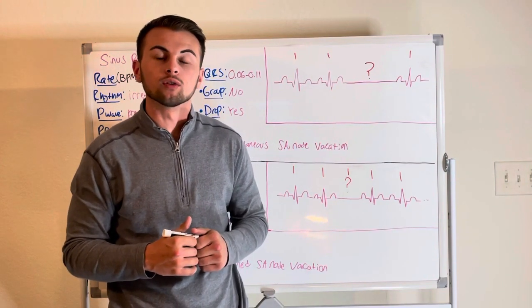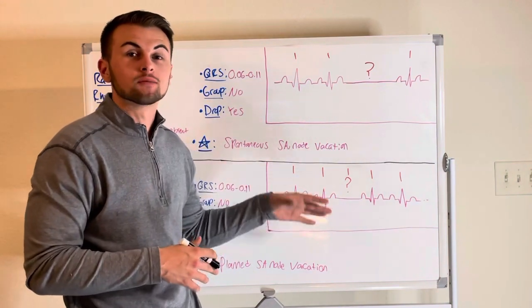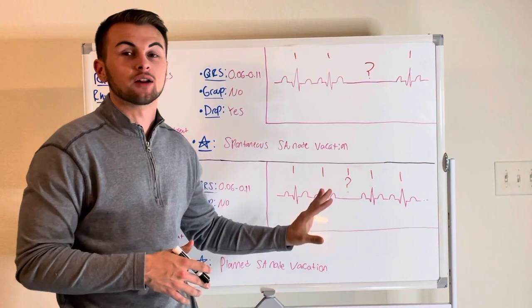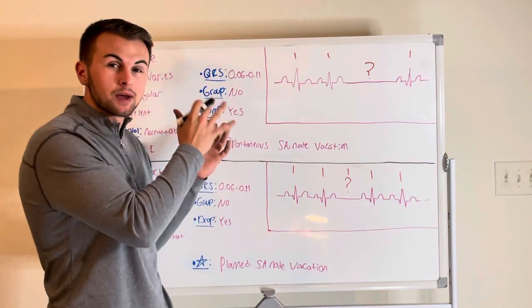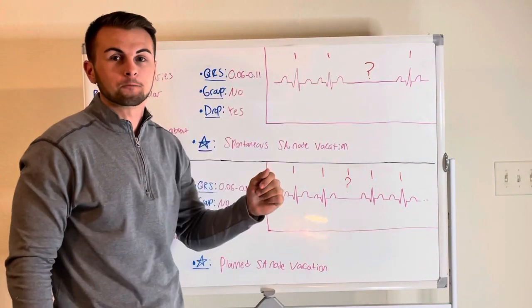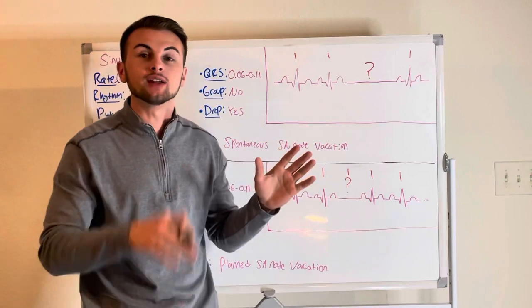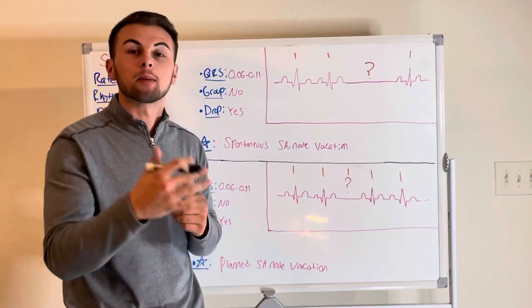Today we're going to go over sinus pause and sinus block, or sinoatrial pause or sinoatrial block. So a sinus pause is basically an irregular, unpredictable beat drop. So think about your friend DJ Sinus Pause. He's unpredictably just going to drop a beat on you.